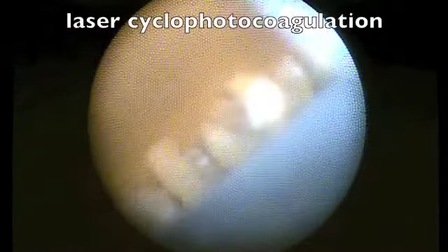the endoscope. All this I am visualizing on the screen in front of me, not through the microscope. These are the ciliary processes, and this is how the photocoagulation is done. You can visualize photocoagulation of the ciliary processes here.